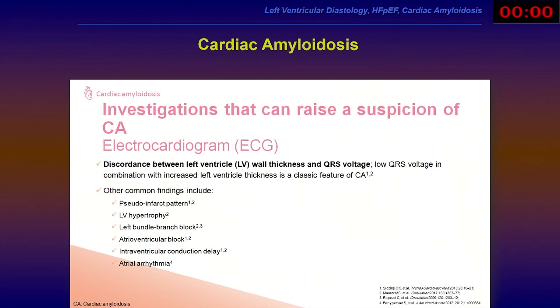Discordance between left ventricular wall thickness and the QRS voltage, I mean low QRS voltage.